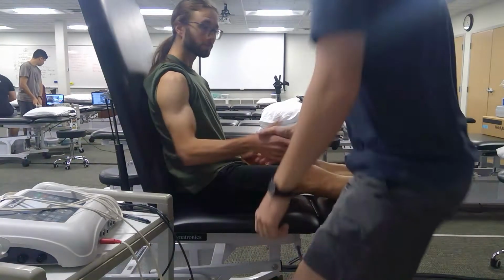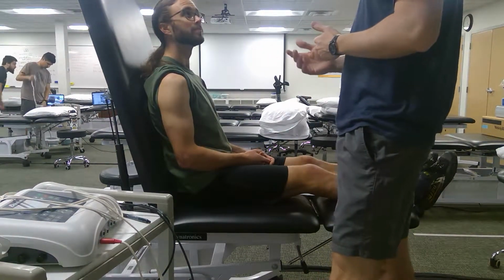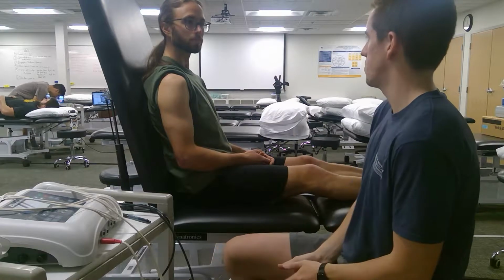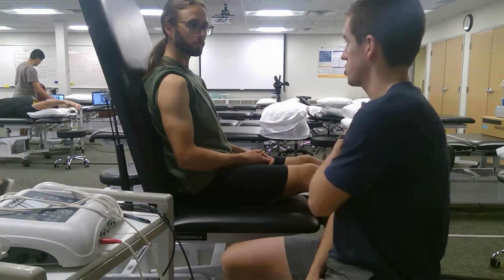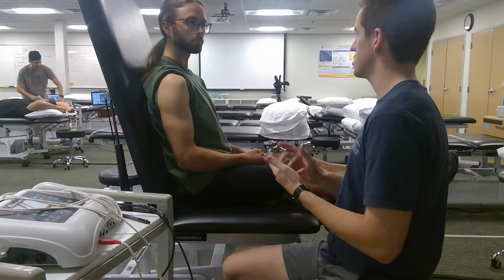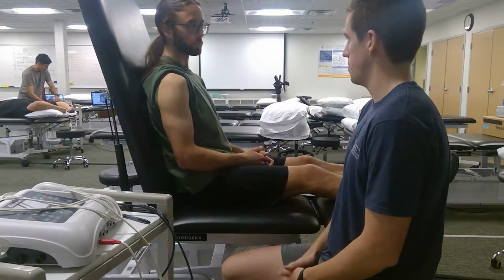Hi Greg, my name is Josh. I'm a doctoral student of physical therapy under the direction of Dr. Clausen. You're coming to see us with some right shoulder pain, some osteoarthritis that you have there. And so what I'm planning to do today, what I think would be a best fit, is some high frequency TENS, electrical stimulation of the shoulder. Basically it should feel like a light tingling sensation. It should be very comfortable for you, and it should help to reduce that pain afterwards. Is that all right by you?